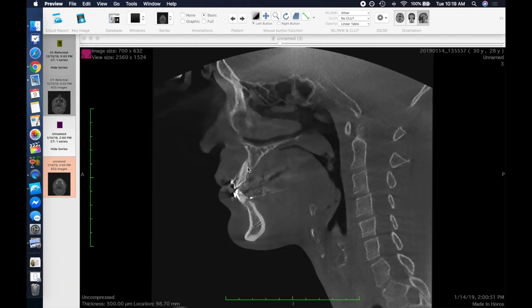All right, tooth number 10. Now you can see the tip of the root of tooth number 10 has absolutely no alveolar bone anywhere on the front side of it. Before AGGA, there was some bone coming up and over the tip of the root. Here, there's none. The tooth is forward, you could say, through the bone. There's some bone behind it, but in front of the tooth, there's absolutely nothing, even at the tip of the root.